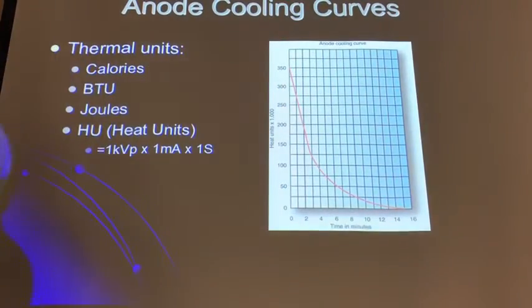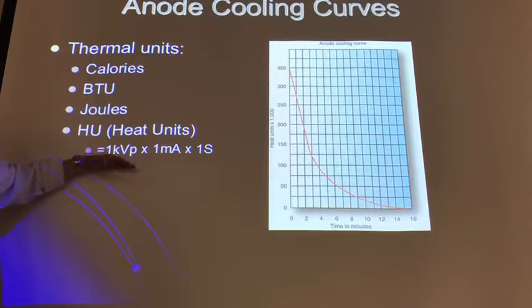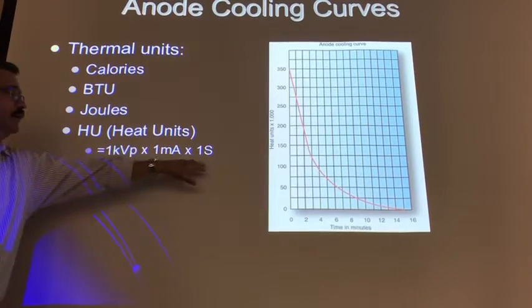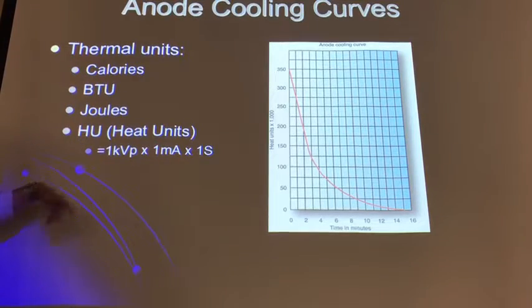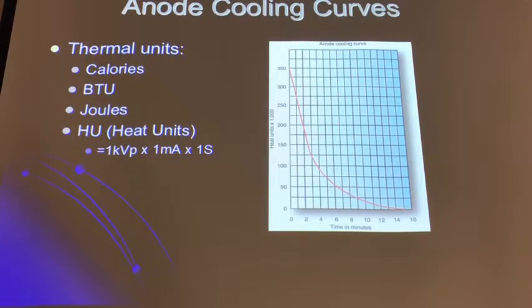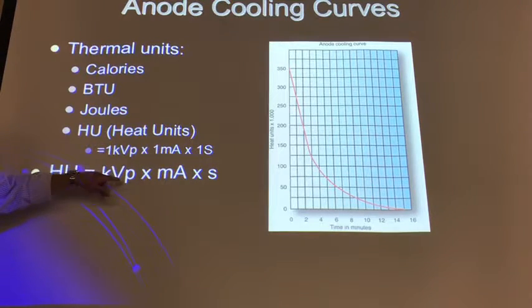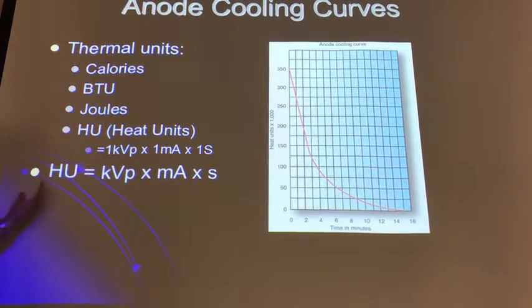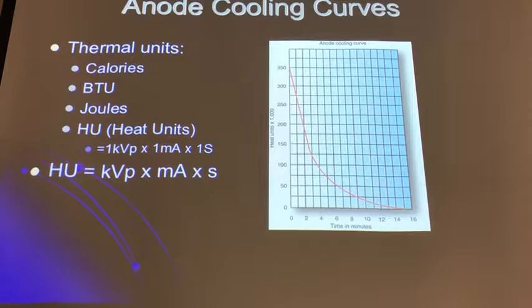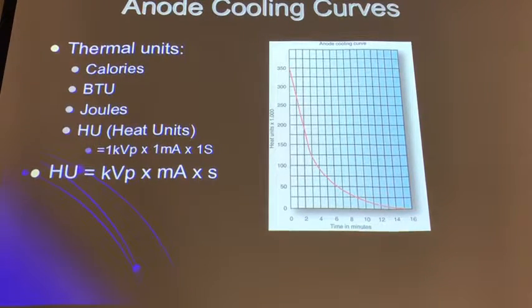And this is important. Depending on the kVp that you use, the mA and the time, now you can have the heat units, okay? It's coming up, but in just a bit you'll see. Heat units, for example, what you do is you multiply the kVp, the mA, and the time. So mA, time, and kVp will give you heat units, okay? And a lot of the newer machines, that's what they present to you, and that's what it is here too, as you can see, okay?